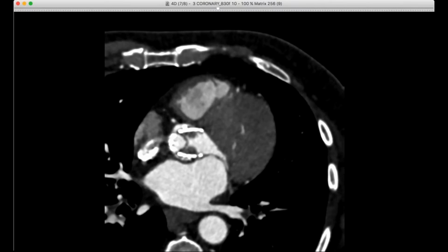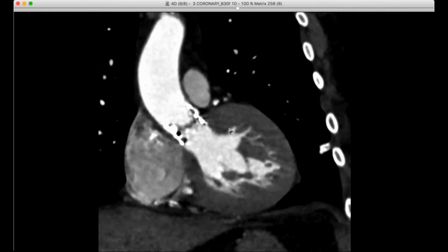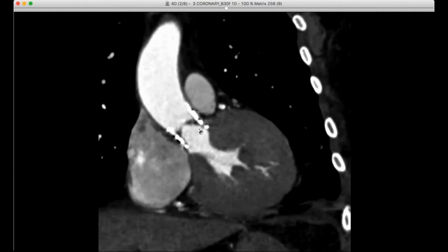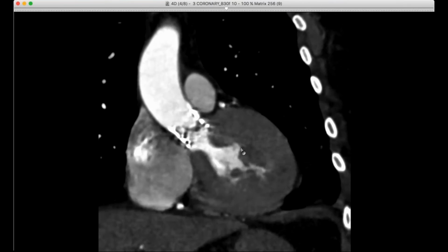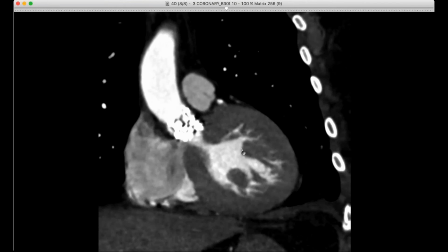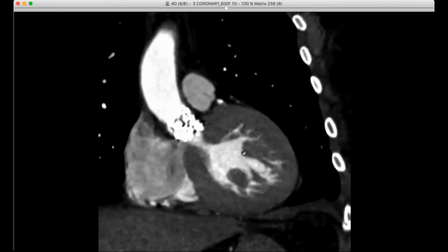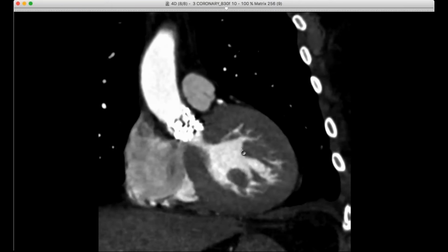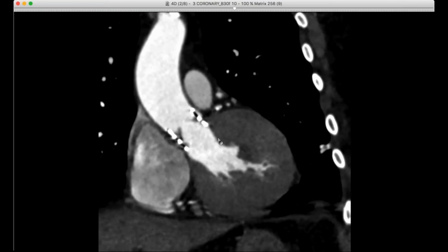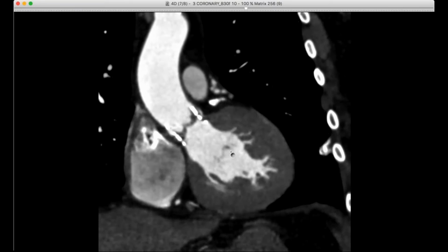Let's reslice that and show another view through the valve. And you can see that this is a very abnormal valve with leaflet thickening and restricted mobility, particularly at the base here. So we haven't had a lot of experience with post-TAVI cases, but we've had over the last few weeks at least a couple of cases of valve leaflet thrombi, and presumably this is another case of thrombi, and this one's fairly dramatic because you can see that all of the leaflets are thickened and presumably affected with thrombus.